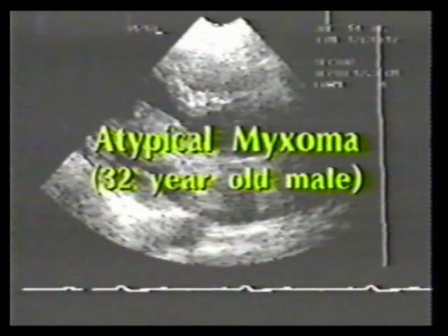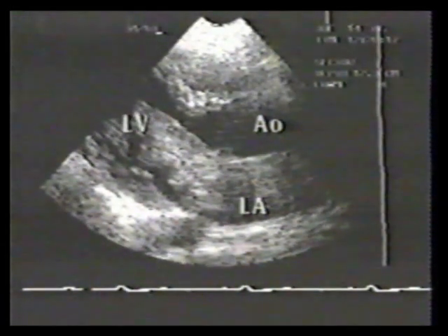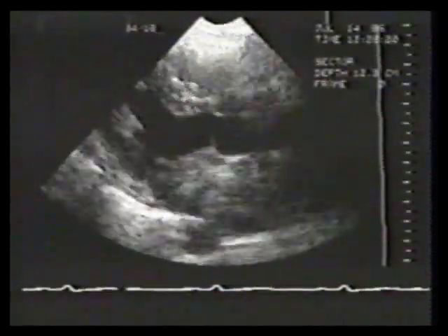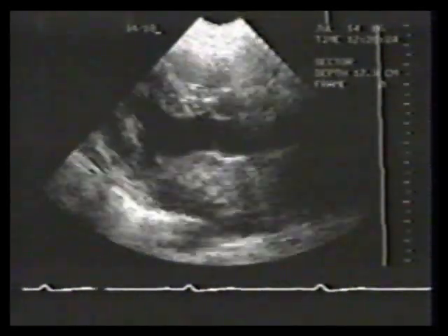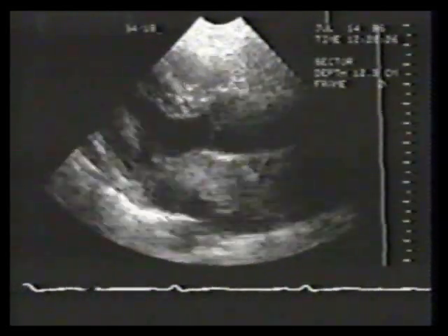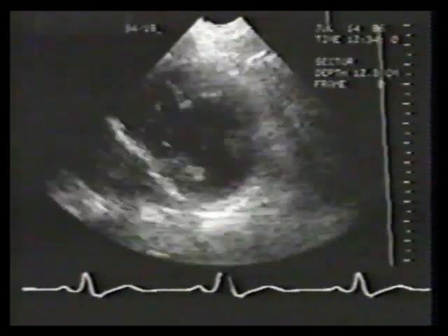This is an example of an atypical tumor in a 32-year-old man. Note that the left atrium in this parasternal long-axis view is filled with tumor. The mass prolapses through the orifice of the mitral valve and has many of the features equated with left atrial myxoma. In such examples, multiple projections should be obtained.